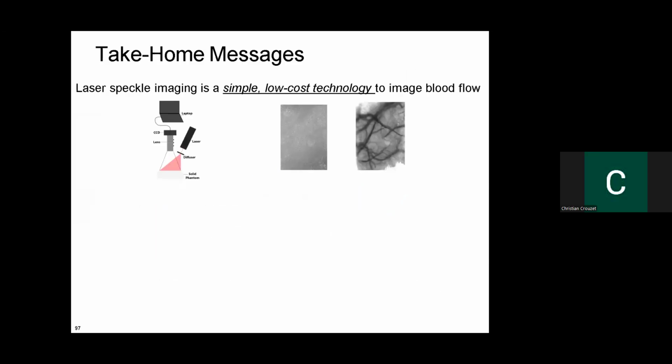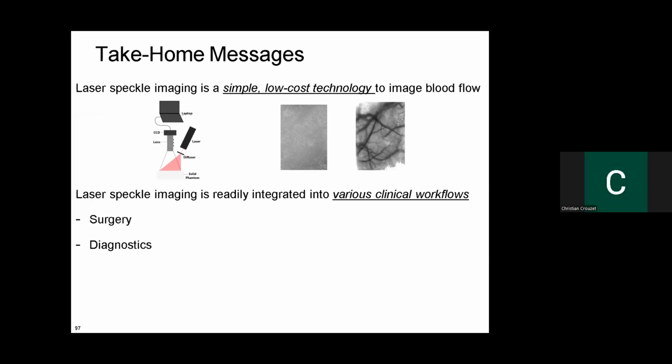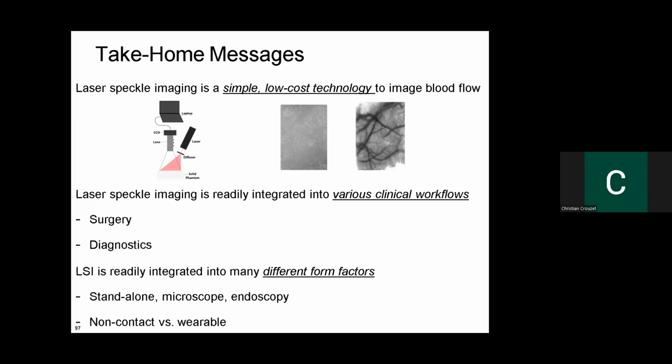So with that, going into the take home messages: LSI is a fairly simple technology, just a laser, shine it on your tissue and collect it with the camera and have a CPU to control it. It can be used in clinical devices as well as preclinical, for surgery perspectives and diagnostic perspectives. And it can be in different form factors. I talked about the clinical devices on the cart, going into the handheld, going into the finger clip. So having it from a non-contact as well as a wearable perspective.